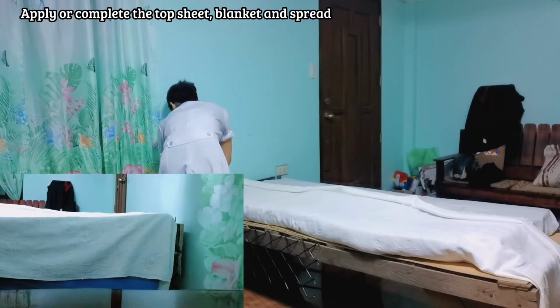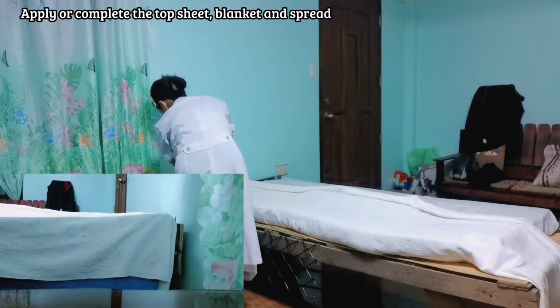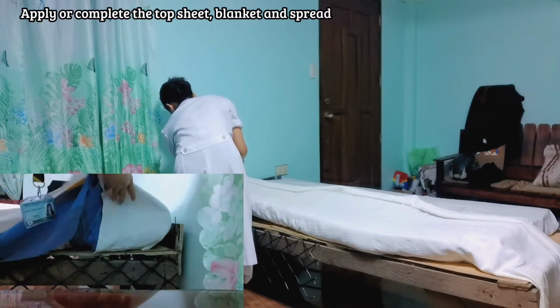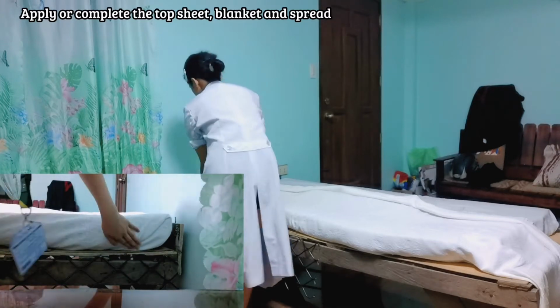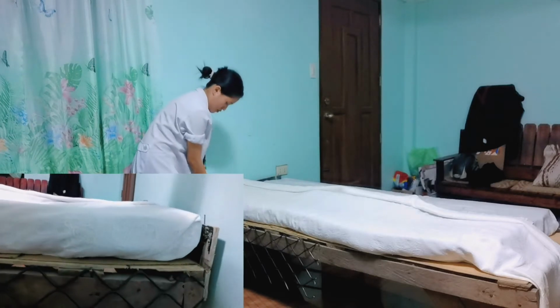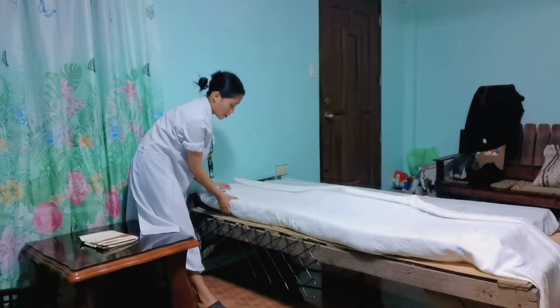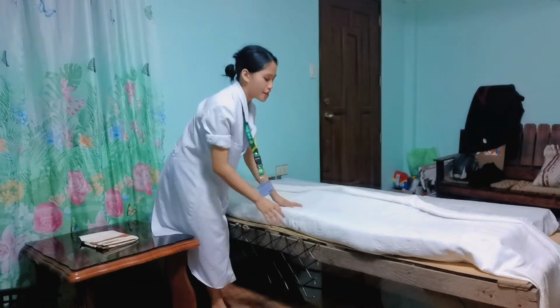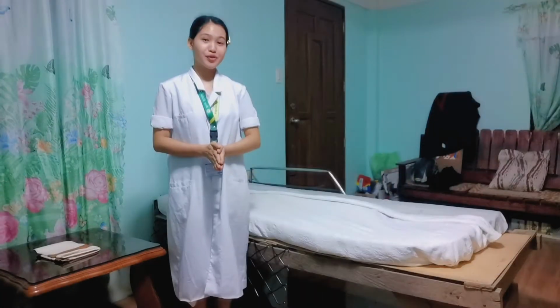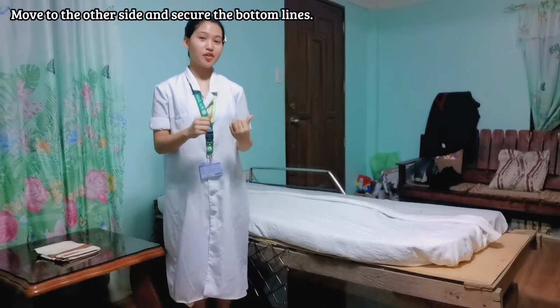And now we are going to miter the top sheet together with the blanket. Make sure that this is wrinkle-free. Afterwards, we are going to move on to the other side.